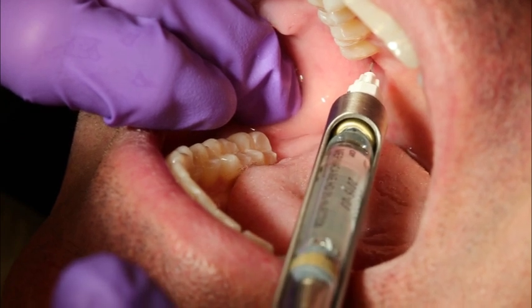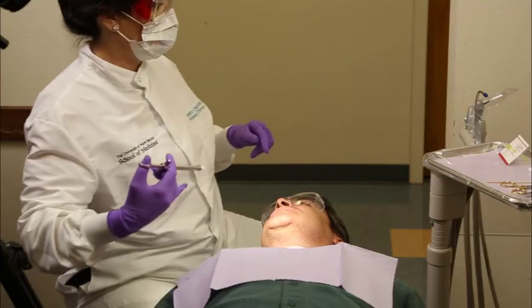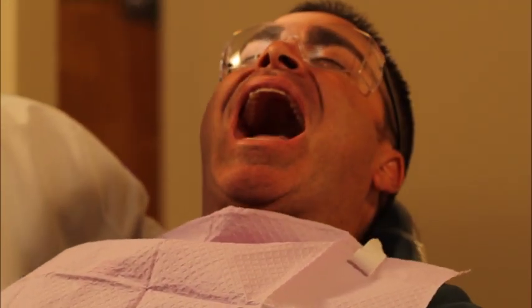Carefully withdraw the syringe and immediately recap the needle using the one-handed scoop method with a needle sheath prop or other recapping device. Seat the patient upright immediately after the injection and instruct him to keep his mouth open for 2 minutes until indications of inferior alveolar nerve anesthesia are present.